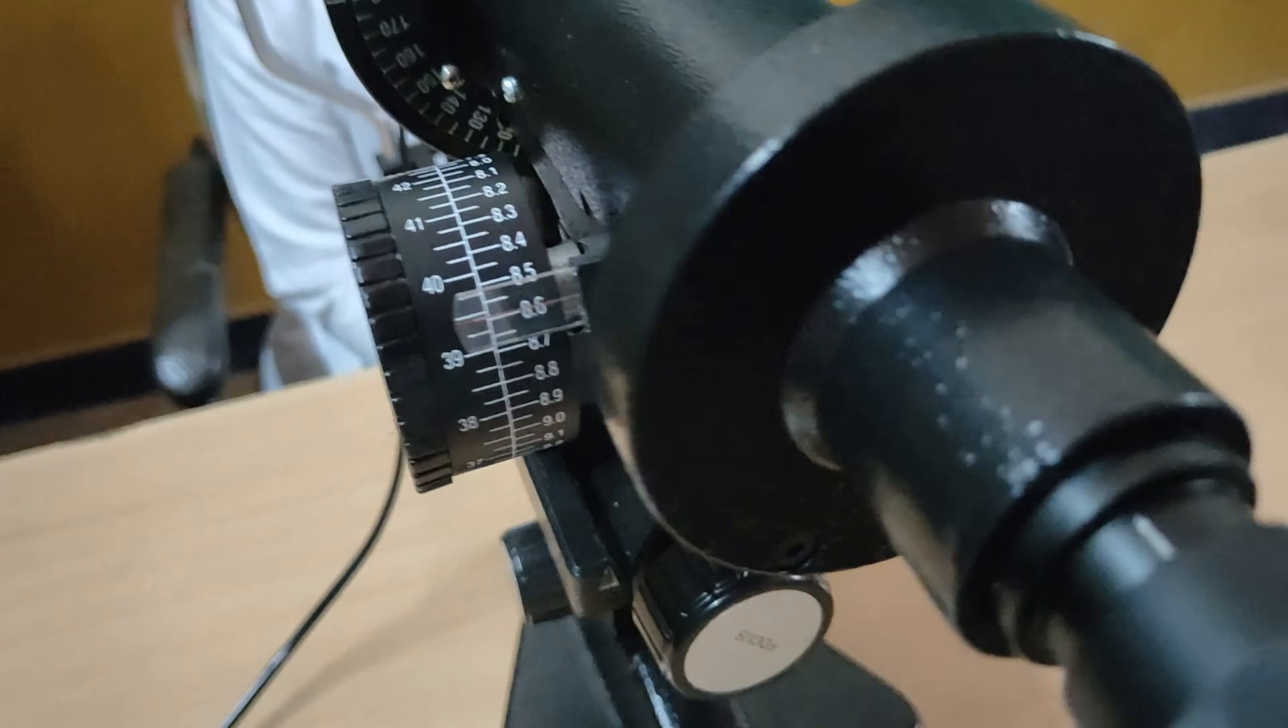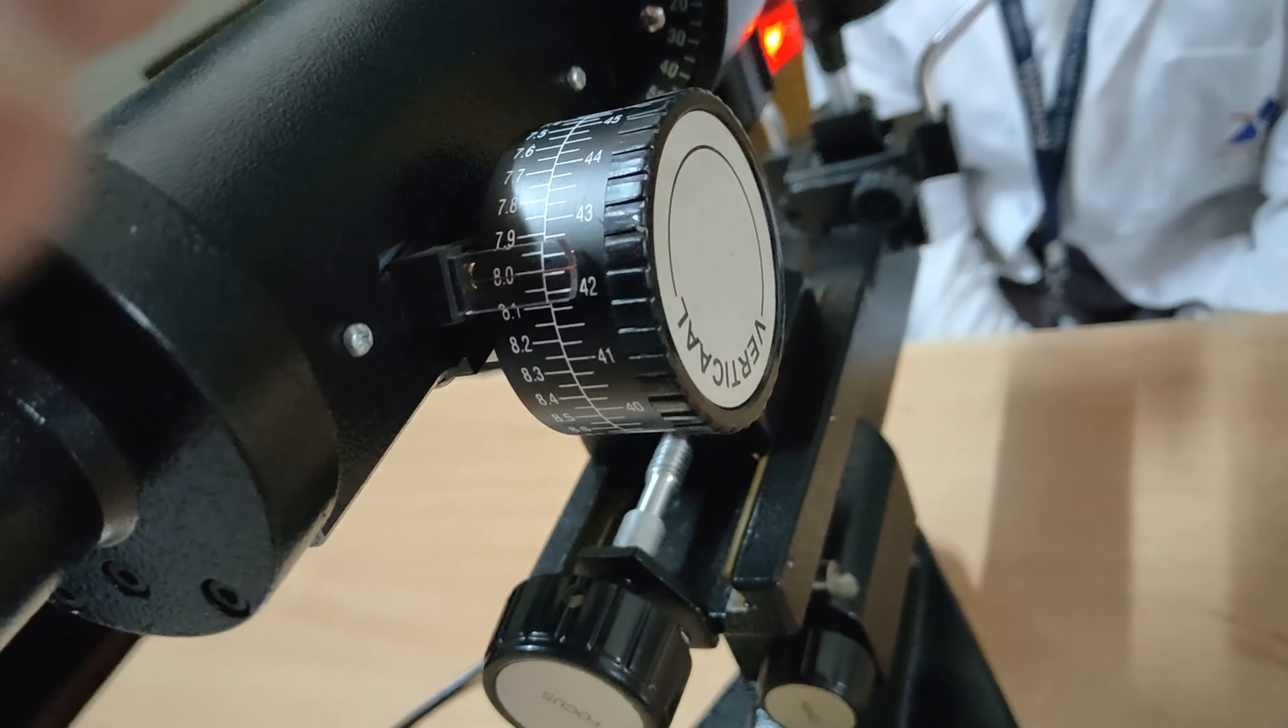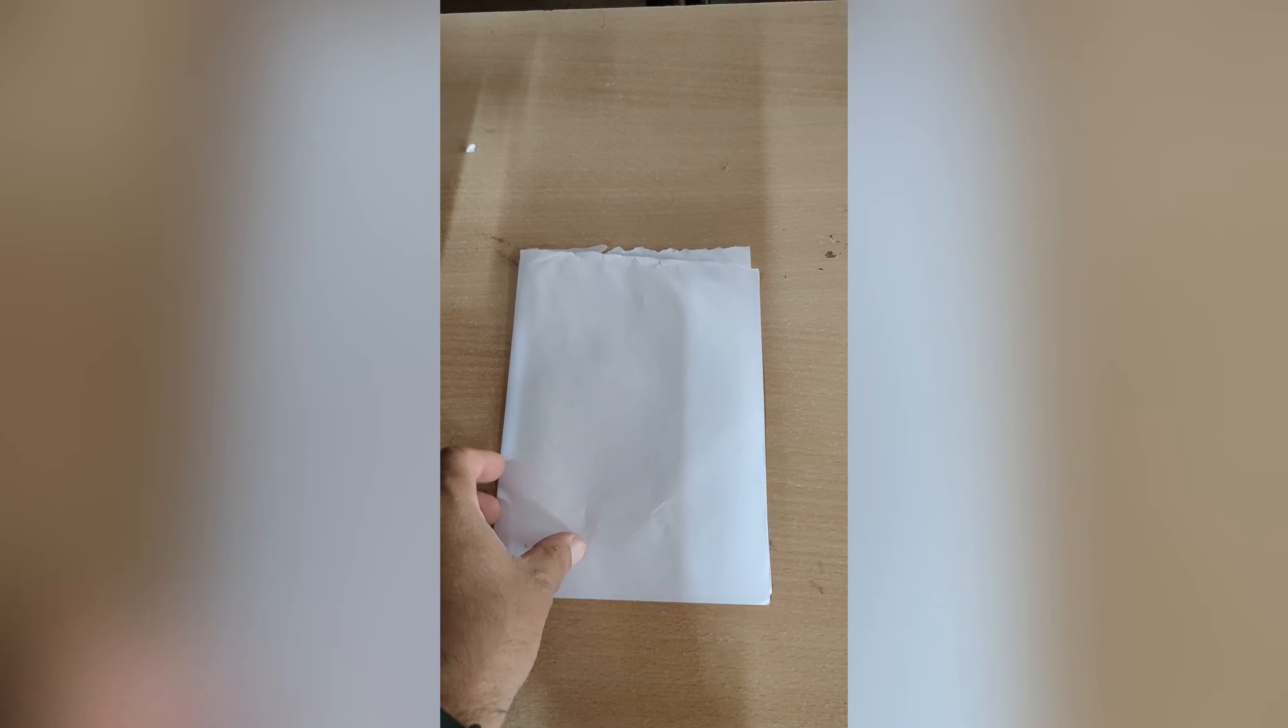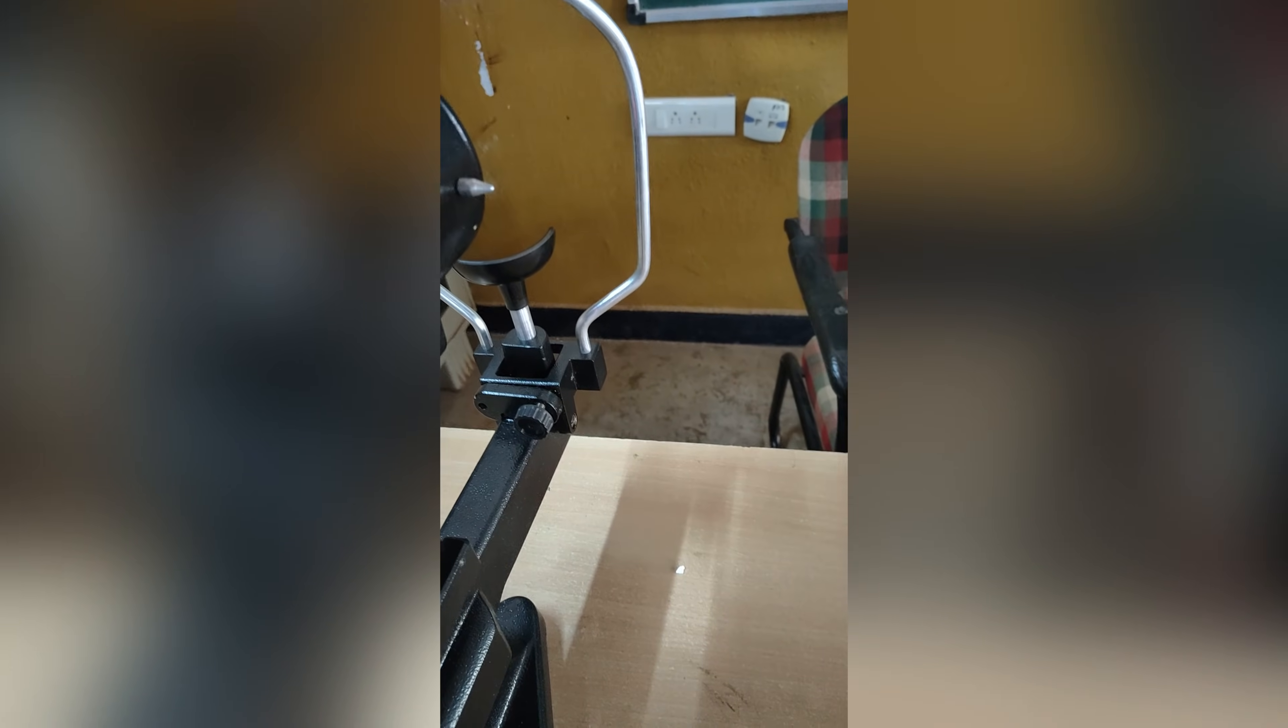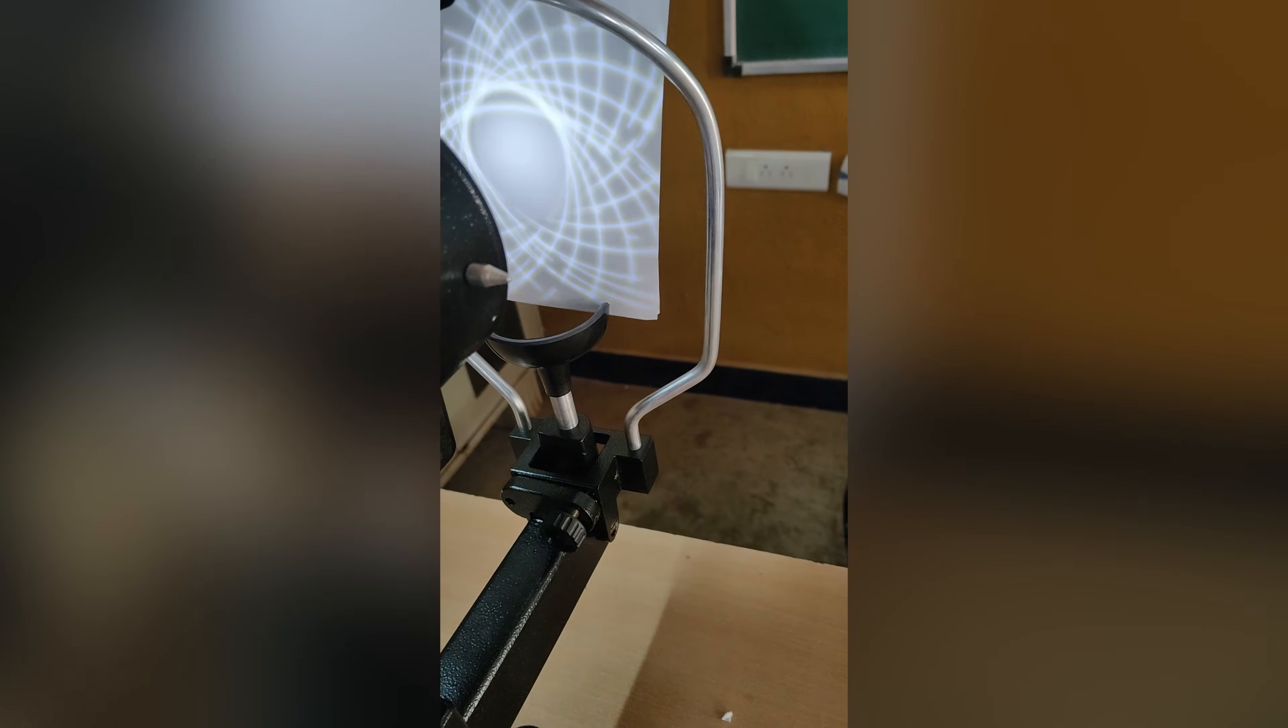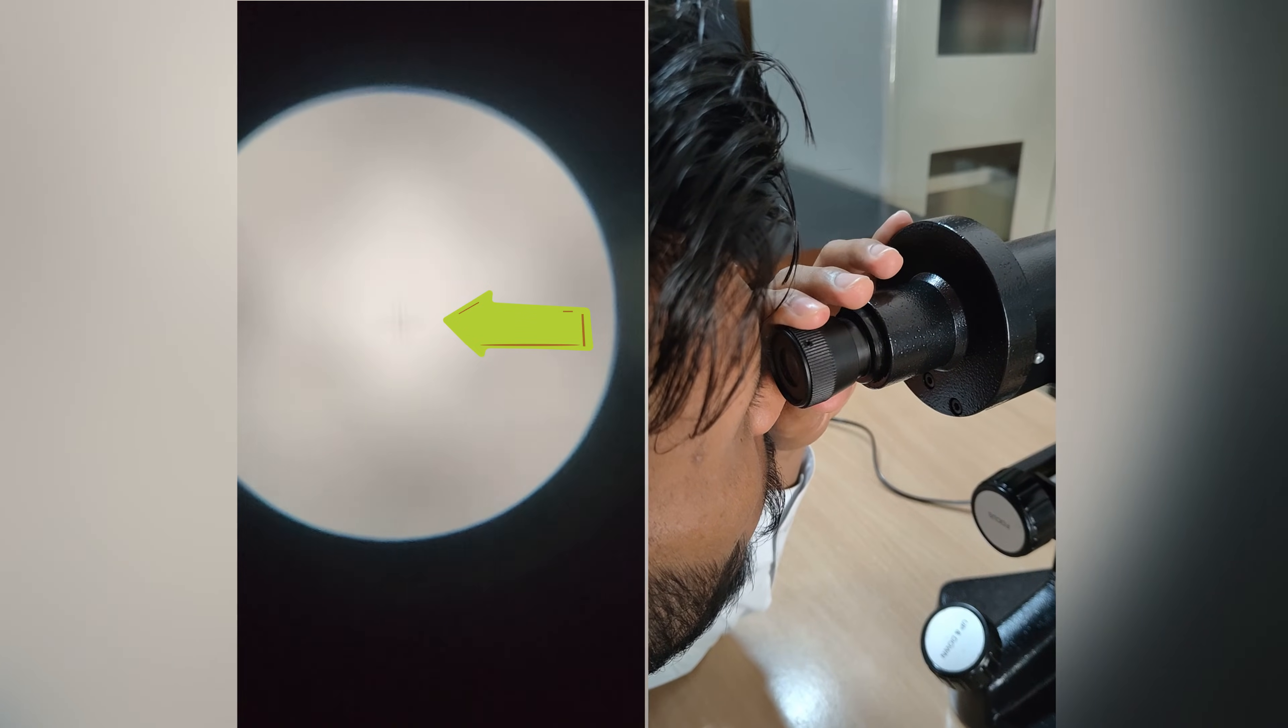Procedure of keratometry. First step is calibration. Keratometer has to be calibrated before use to ensure the accuracy of the measurement. To ensure calibration, focus the eyepiece. Place a white paper sheet in front of keratometer and focus eyepiece until the plus sign becomes clear.